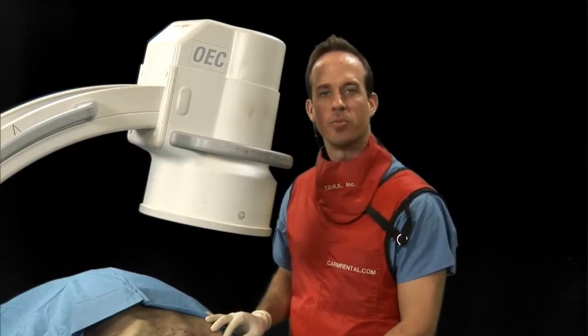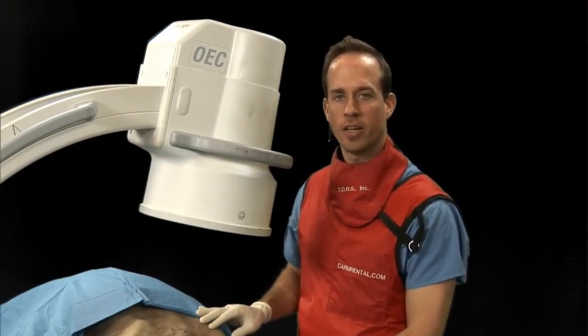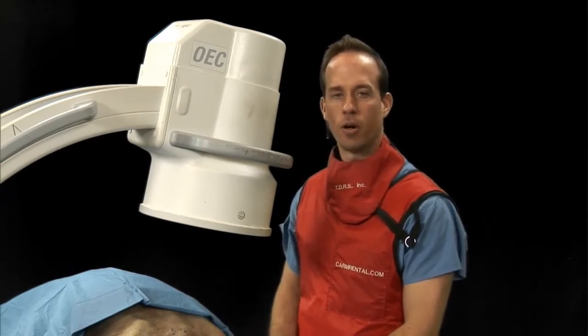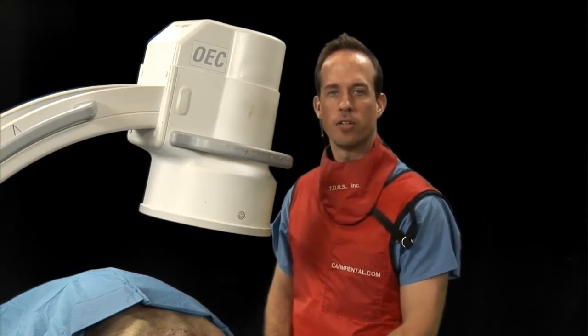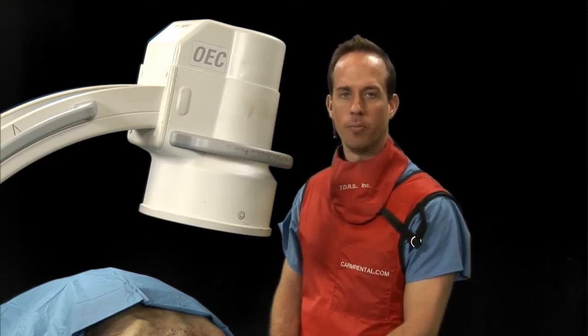Hello, today we are going to be describing the cervical cooled radiofrequency ablation technique for our patients who have cervical facet joint pain, which are quite prevalent in our practices.